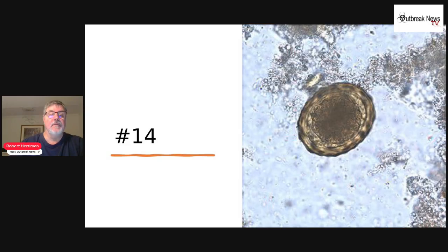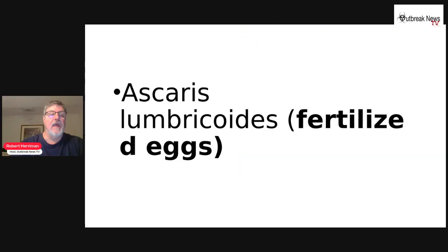Okay. This is pretty characteristic of a fertilized mammillated egg of the Ascaris lumbricoides. This is a fertilized egg.